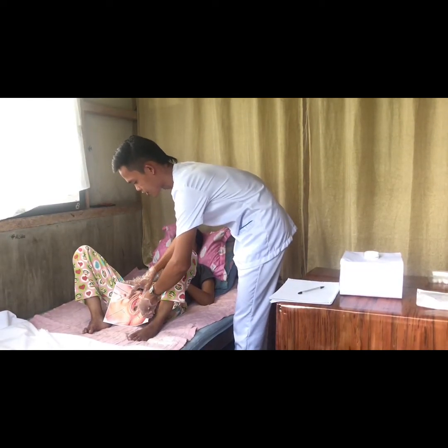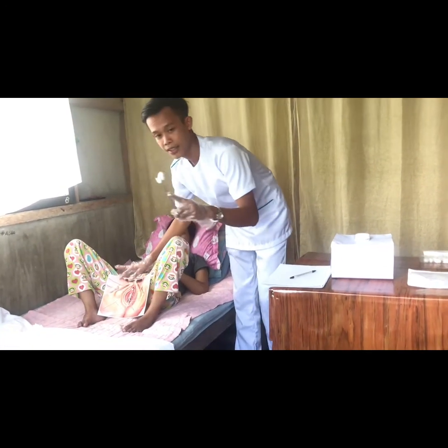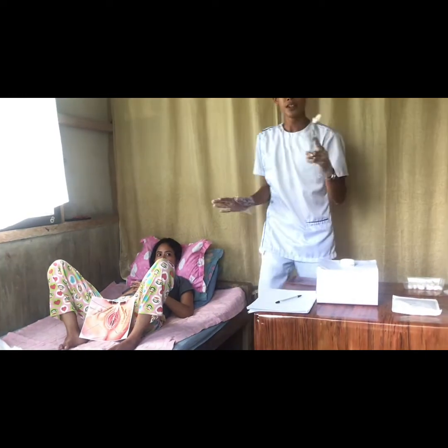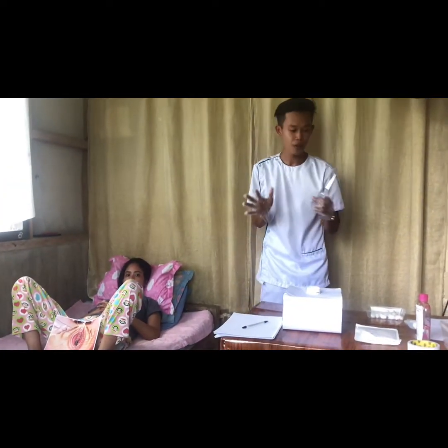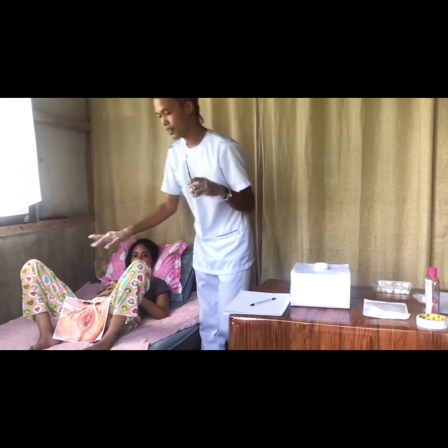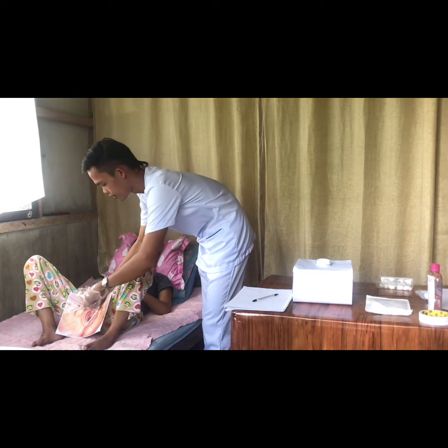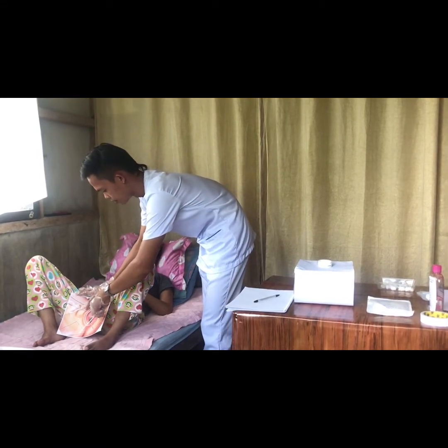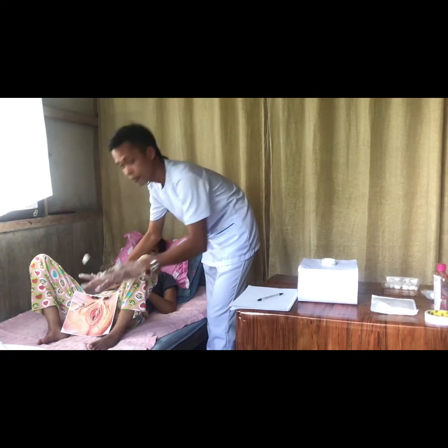Okay. So how are you, ma'am? I'm fine. Okay. And then after that, we're going to dispose of it in the trash can. Same procedure that we're going to do for the second cotton ball. We're going to soak it with disinfectant solution, and then for the second time, we're going to clean the labia, top and bottom. And then after that, we're going to dispose of it immediately.